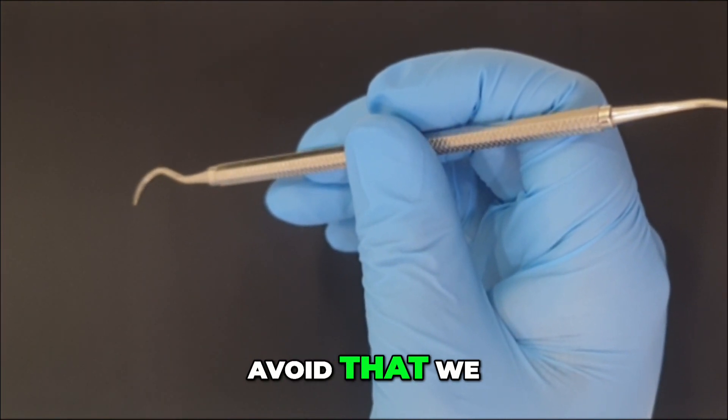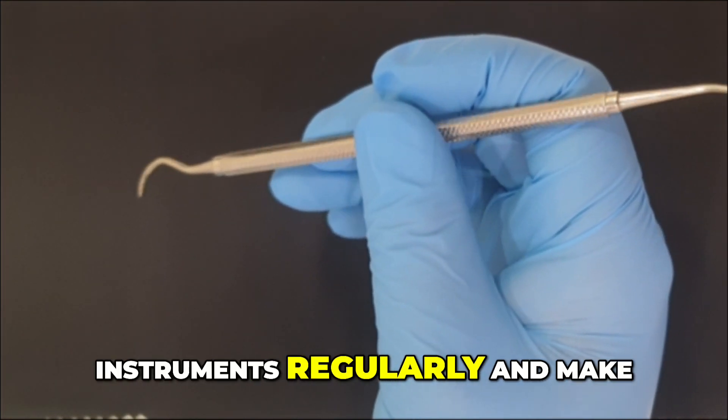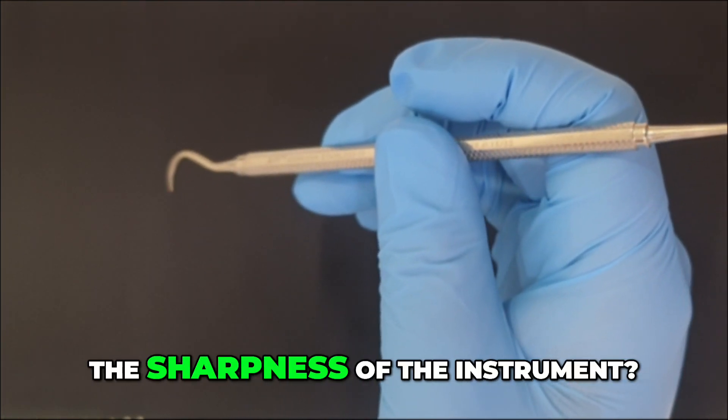So in order to avoid that, we need to sharpen our instruments regularly and make sure it is sharp. How to check for the sharpness of the instrument?